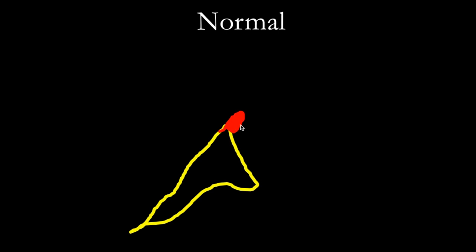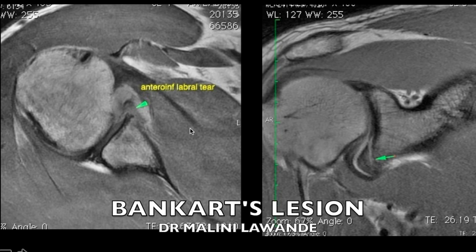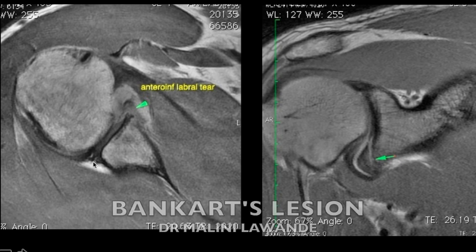On an axial image, this is how the normal labrum is seen in relation to the glenoid. If there is a tear of the anterior inferior labrum and the periosteum attaching to the bone is also torn, it is a cartilaginous or fibrous Bankart lesion. We do not do arthrograms anymore since quite a number of years, because with high-resolution imaging — especially with 3 Tesla — it is possible to get very high resolution proton density images which can show the labral tear very well. Here you can clearly see the posterior labrum is normal, while there is an anterior inferior labral tear.